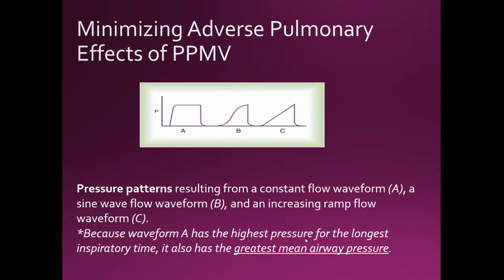Now again, if you want the highest amount of airway pressure, go with your constant waveform because it's remaining at that pressure for a longer period of time, versus the sine wave, sinusoidal, I guess that's how you pronounce it, waveform, and your ramp flow.